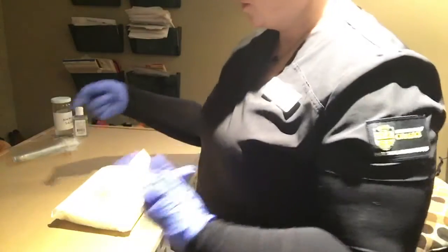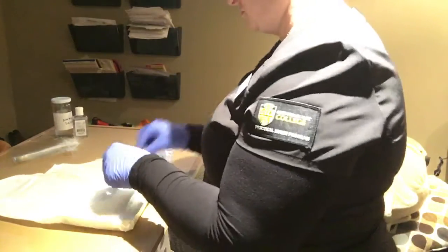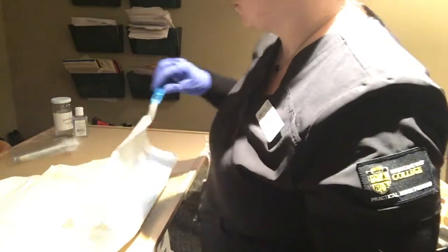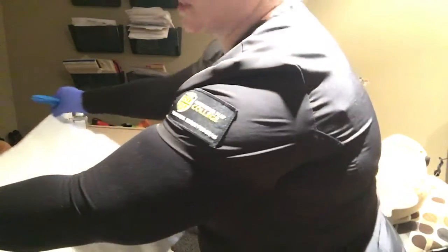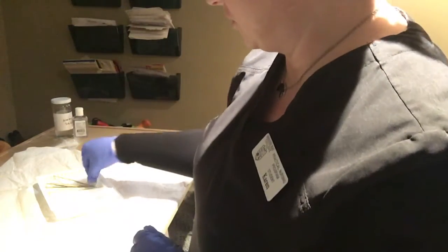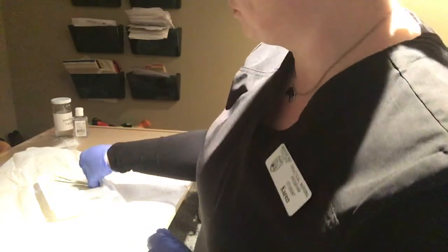Okay. With our sterile field, we want to keep it away from us, so we want to pull it outwards. Okay, and now with the sterile field, there's a 1-inch border around that's not considered sterile. I'm going to toss this away, my tongs, and then being very careful, I'm going to take my little tweezers out, placing them within the 1-inch border.